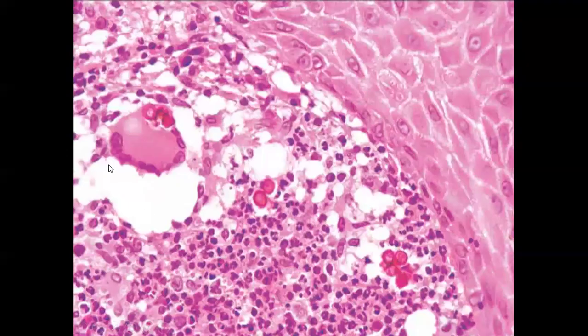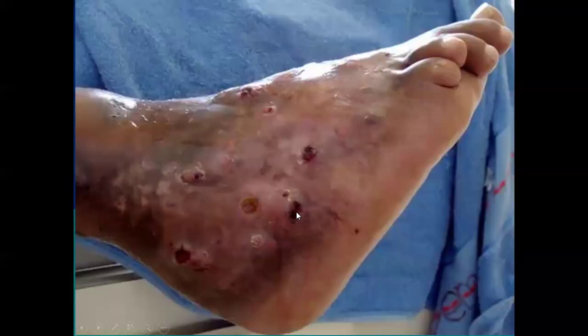Another kind of deep fungal infection, which is associated with a large infiltrated plaque or nodule, is chromoblastomycosis. And you can see the copper pennies. These are small, and again, they are visible without special stains. They are seen in the macrophages as well as outside the macrophages.